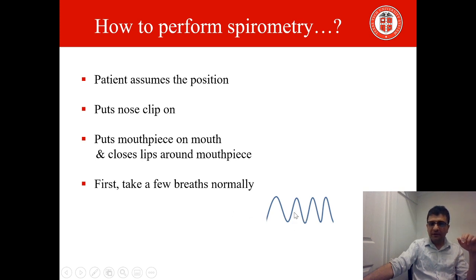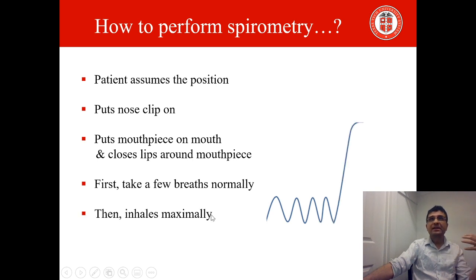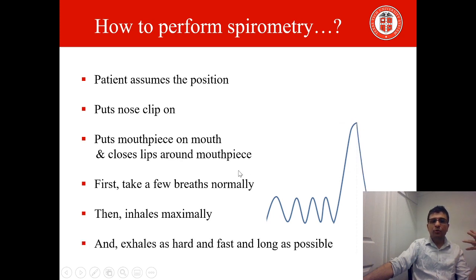And after taking a few breaths normally, we take a deep breath in, as much air as you can inhale, and then you will reach this peak, and then at this peak you try to exhale as hard, as fast and as long as you can.